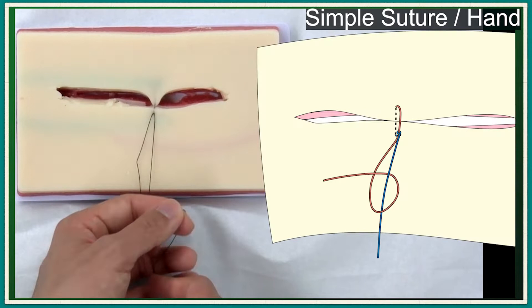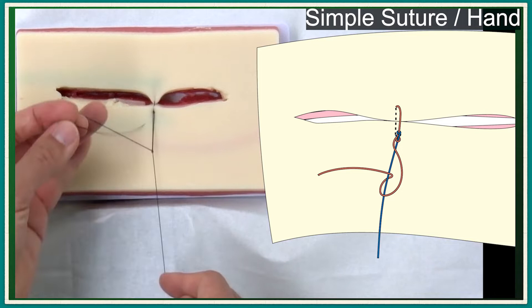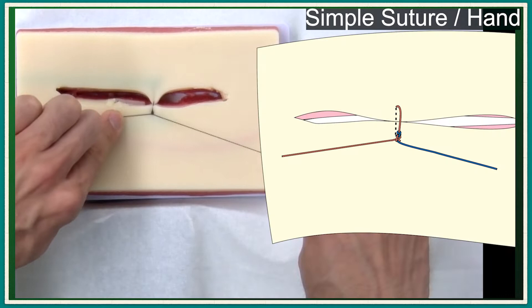Now you can use your left hand freely. The suture knot is secured by additional knots formed by one-handed knot tying. The left hand should be pulled vertical to the suture line. Don't push the knot parallel to the suture, or the knot may slip on the suture and tension will become too tight. After you secure the knot, both ends are pulled vertical to the suture line.